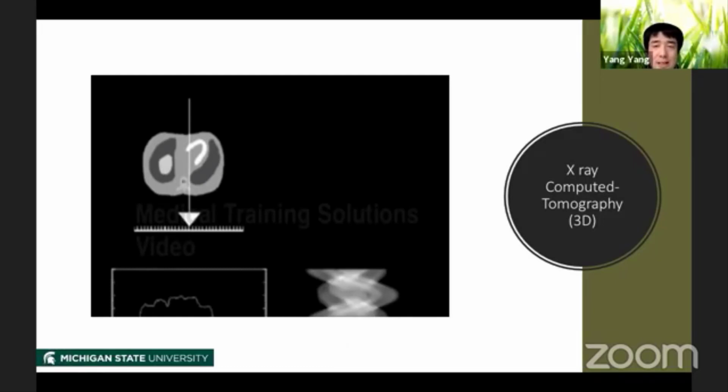And this technique is known as X-ray computed tomography. Computed means we need to use a computer to aid the computation of the image. Tomography means imaging by slice. And these words are often abbreviated as CT. So this is what we call X-ray CT. It's a 3D medical imaging technique.